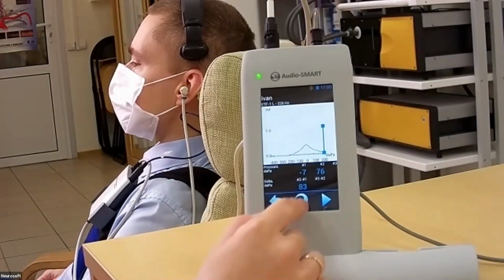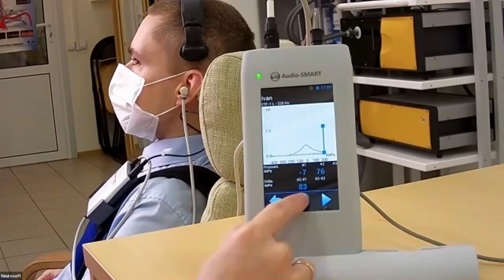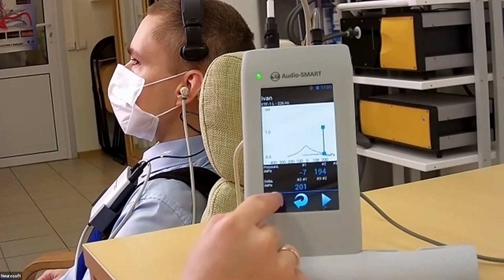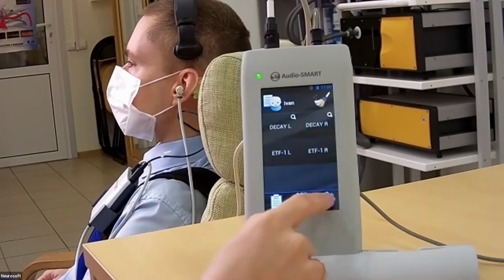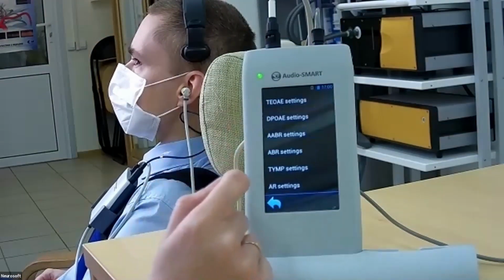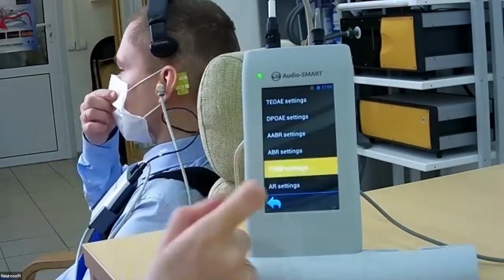Now let's try to rewrite. Let's go to the setup now, test settings.